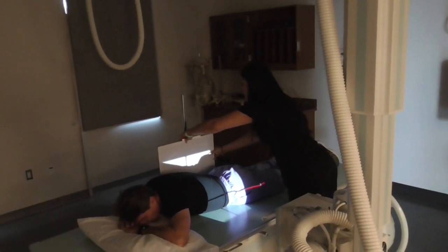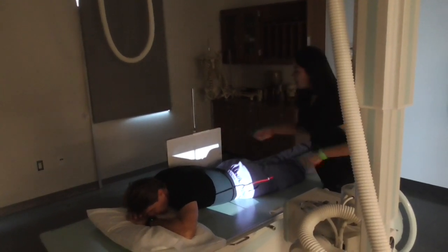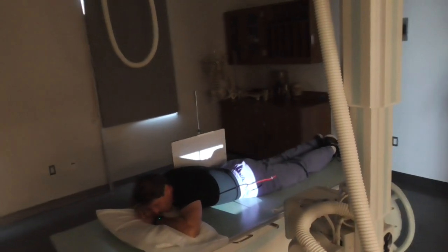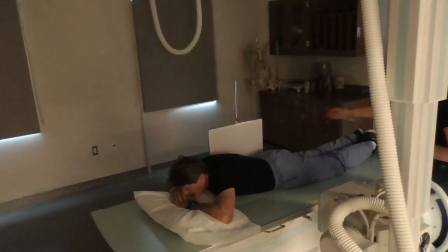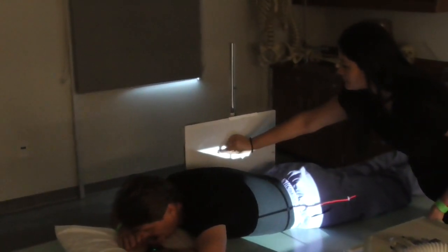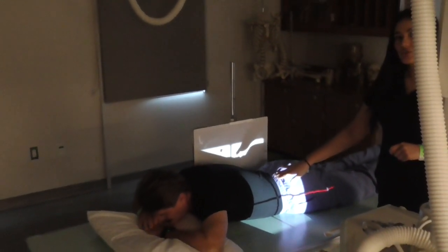Making sure to line it up to my IR as well. So now we have the right side closest to the IR, so I will mark the right side. This is my ventral abdomen decubitus.